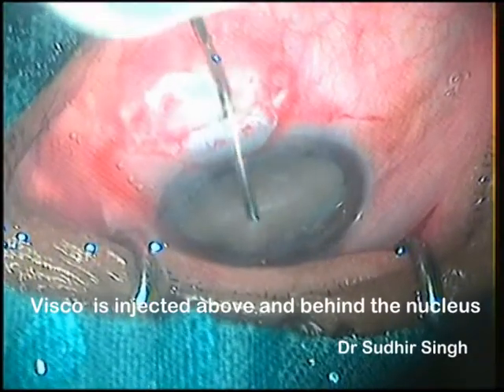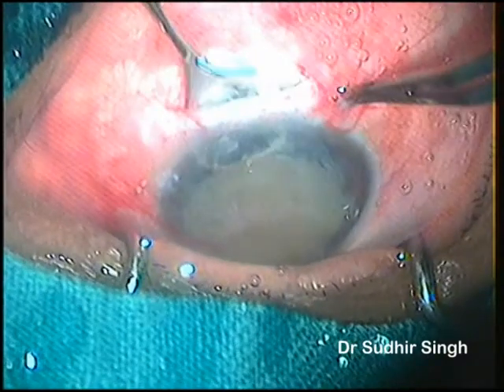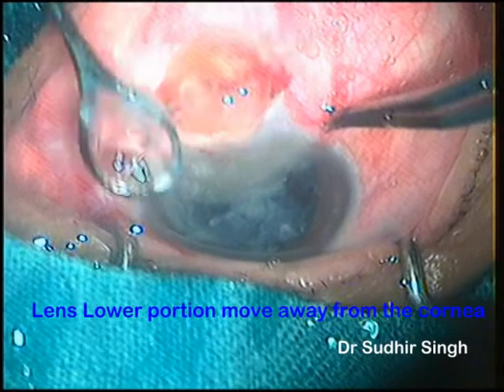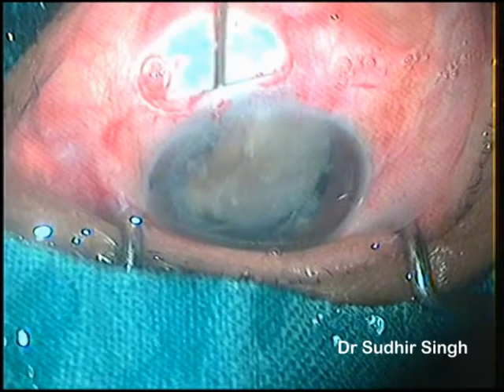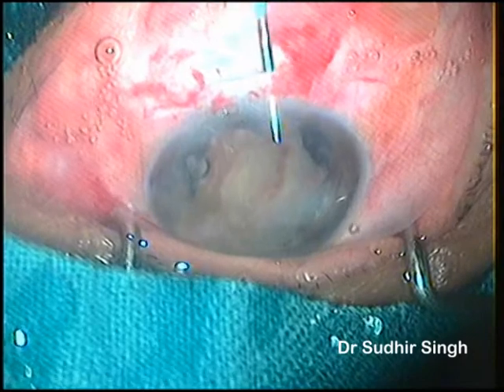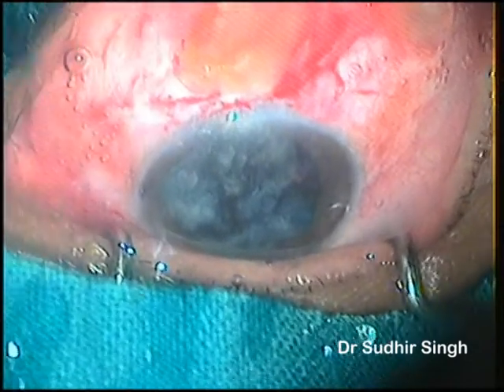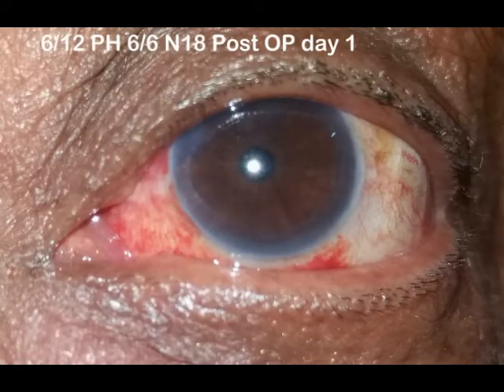Please watch this 6 mm intratunnel phacofracture nucleotomy surgery clip in slow motion to understand better. I hope this video would be helpful to understand the intratunnel phacofracture manual small incision cataract surgery basics.